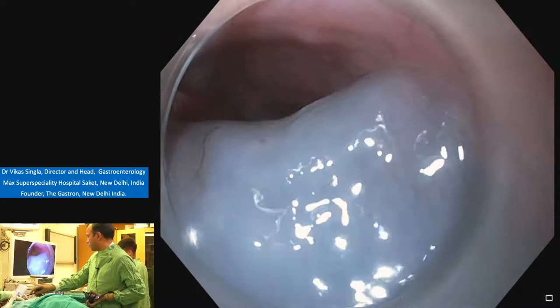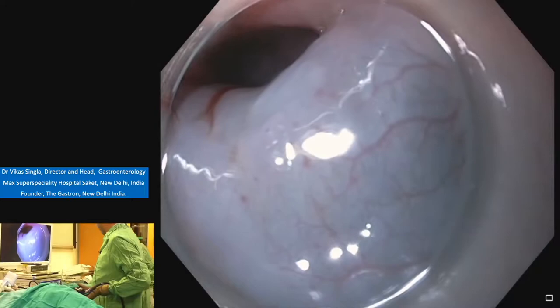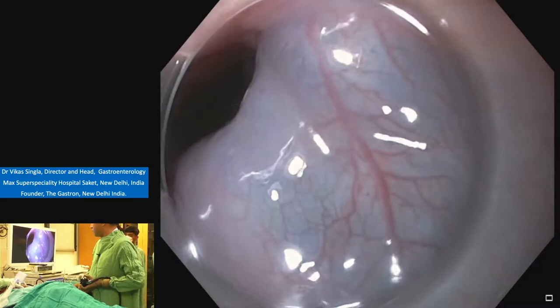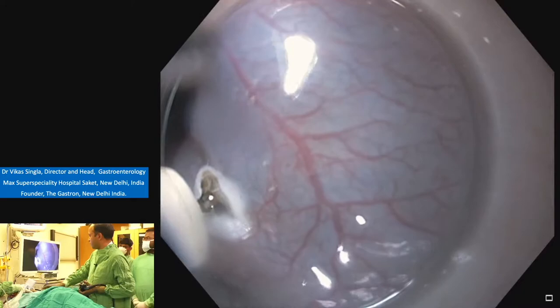The next step is the incision. First we make a hole in the mucosa up to the submucosal layer. First we just touch the knife out, touch the knife to the mucosa, and we are using force coagulation. Then you press on the knife and go deep, then lift, and again initially coagulate and then cut.